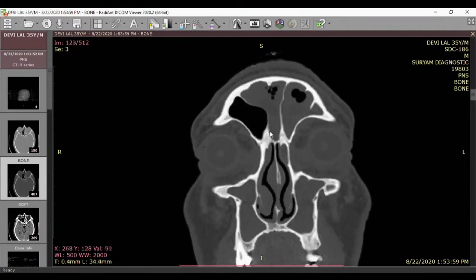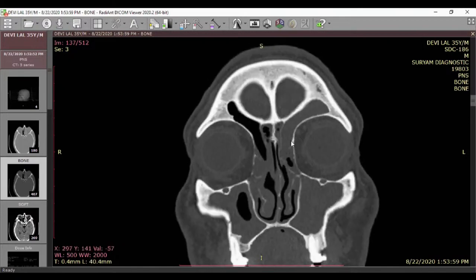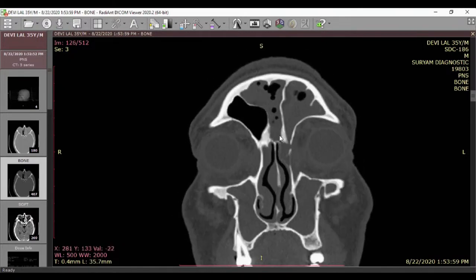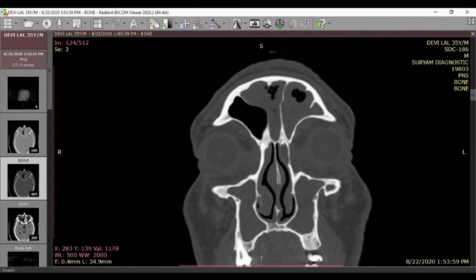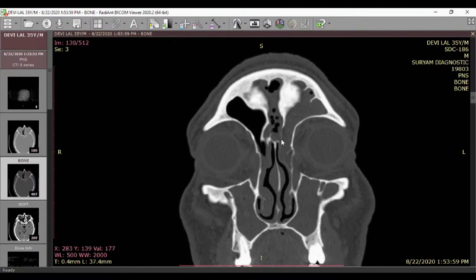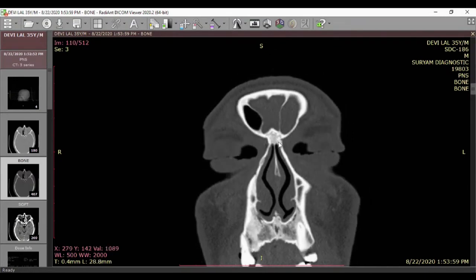Sometimes they make your life so difficult to distinguish. It is your dynamic radiology which can tell you which is the intersinus septal cell and which is the frontal sinus, and you should be very clear about it. Similarly, this is a supraorbital cell. See now, this is your frontal sinus. See the level of the beak. Now, as the beak is going, the frontal recess starts. See, until here was the beak. That's the most anterior picture.